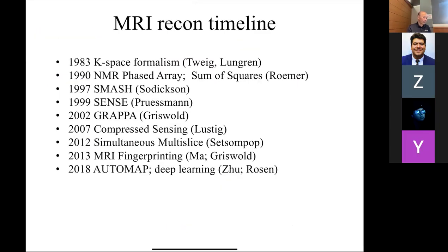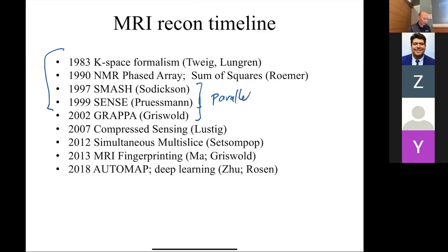Okay, so let's talk about where we were last time. Last time we covered these three things, and we'll review those really quickly. These are in the realm of parallel imaging, where you're still trying to create an image based on just the data you have alone. We found it's useful to have a linear algebra point of view, because you're essentially solving either overdetermined or underdetermined systems. And if it's underdetermined, you're trying to make it overdetermined, right?